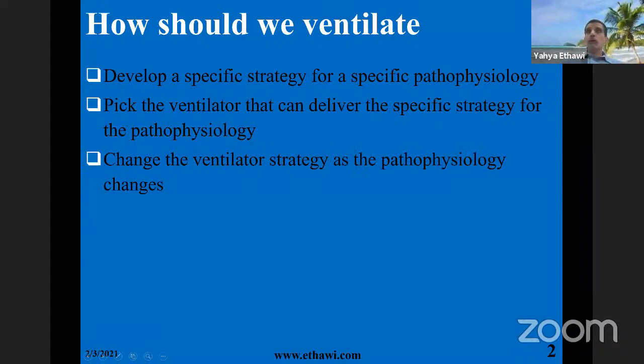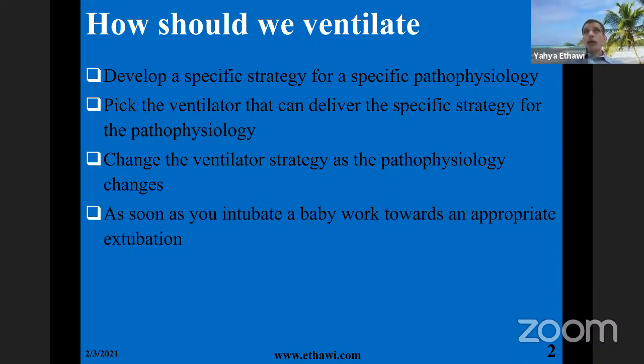Now, the ventilator strategy should change with the change of pathophysiology. So RDS becomes PDA, PDA becomes infection, infection becomes chronic lung disease, becomes resolved, and so on. You always need to change when you ventilate a baby. And the time of extubation should be started at the time of intubation.